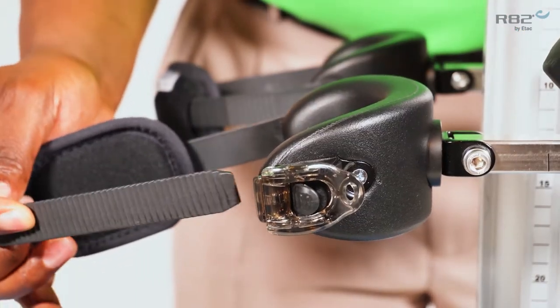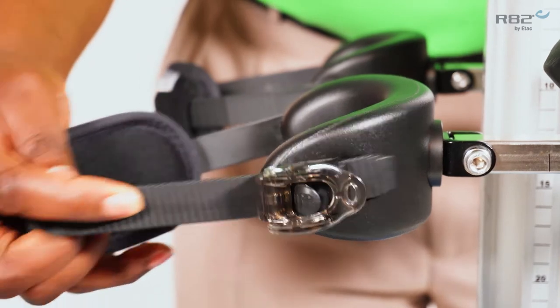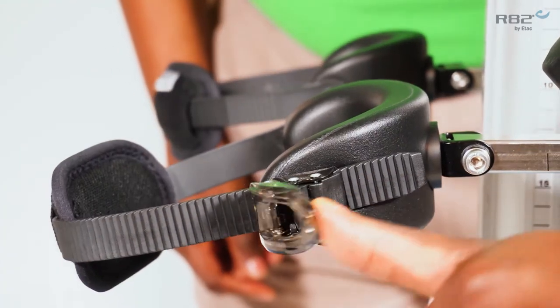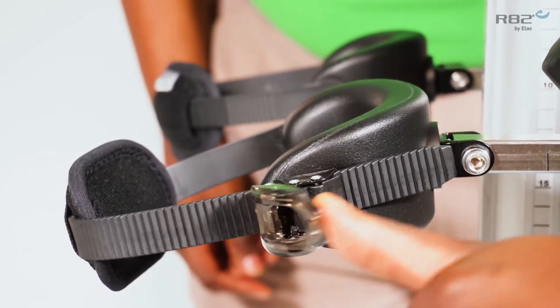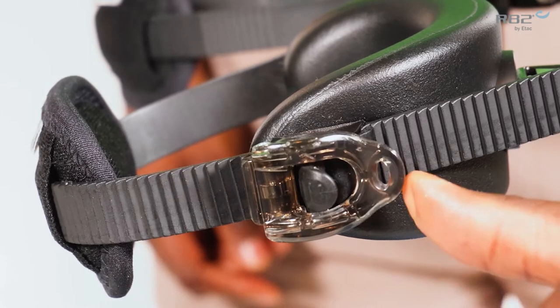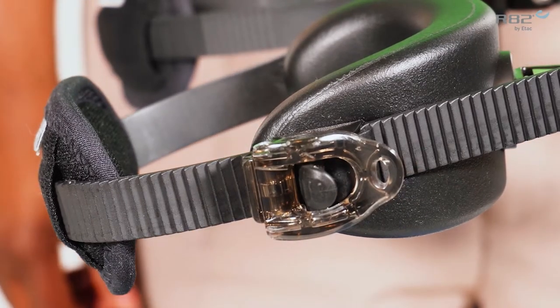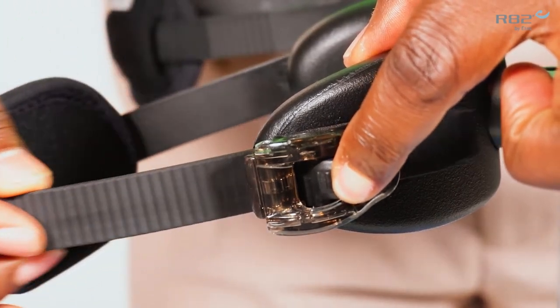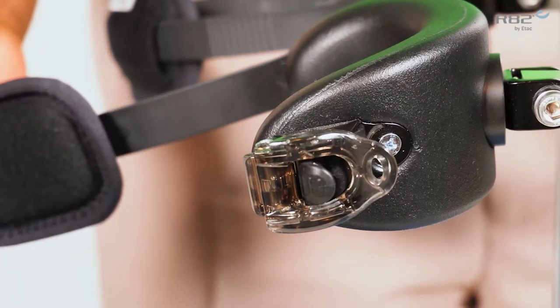The second way to use the ratcheting system is by inserting the knee strap and ratcheting it in. To release the strap, press the center of the ratchet and you're able to release the strap.